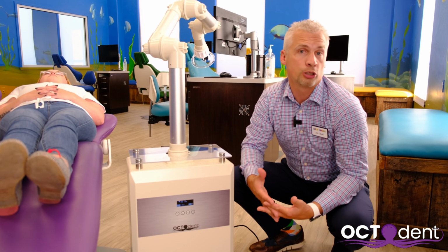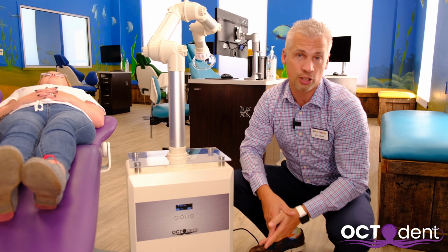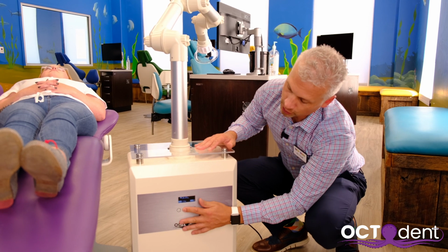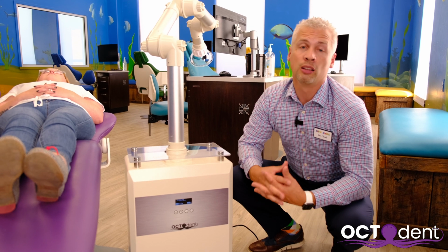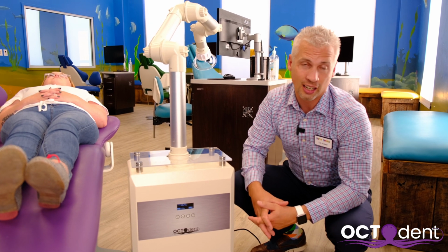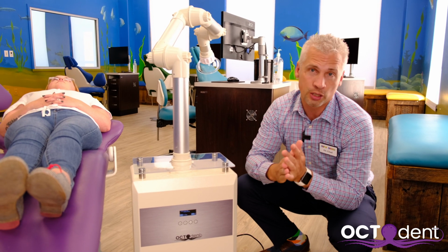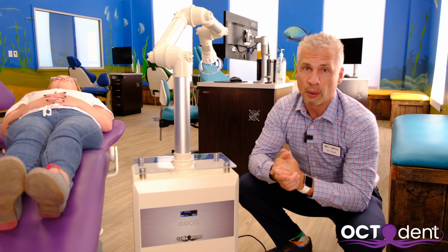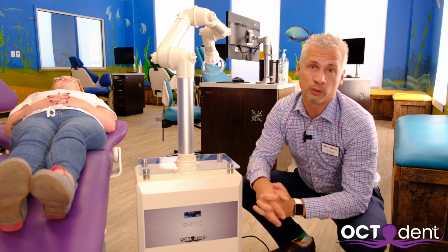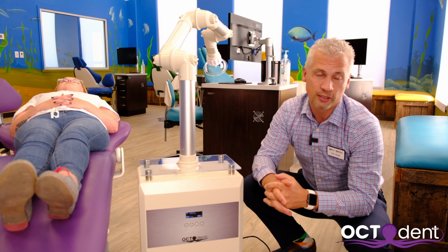Now, for a traditional four-handed dentistry situation, or if I'm doing an assisted hygiene, I usually use level 7. The reason I use level 7 is because I get lots of suction at level 7, more than adequate suction for 6 to 8 inches from the patient's face. But if you notice, I have to talk a little louder. I can still converse, but it's noticeably louder, though not too loud to talk over the machine.